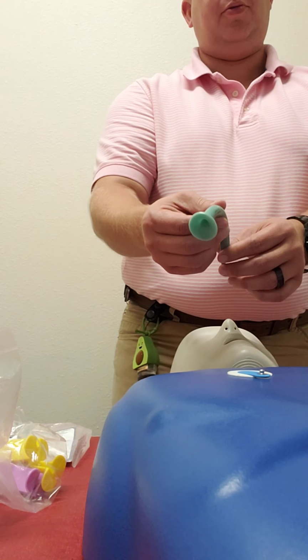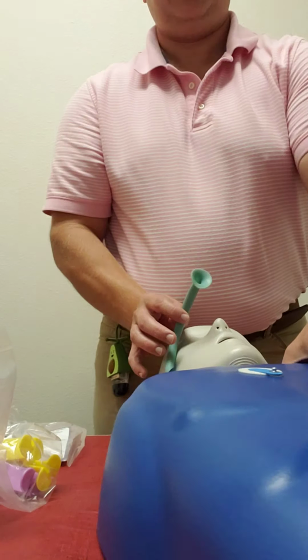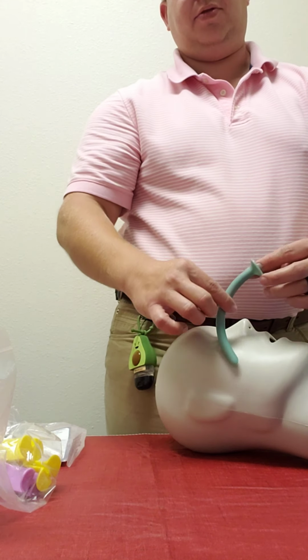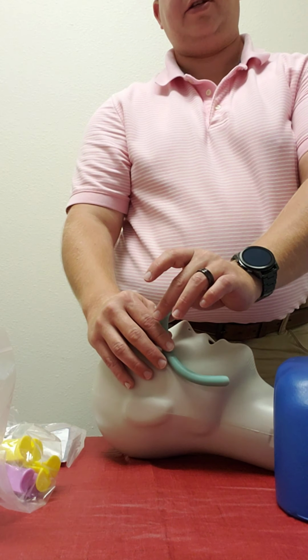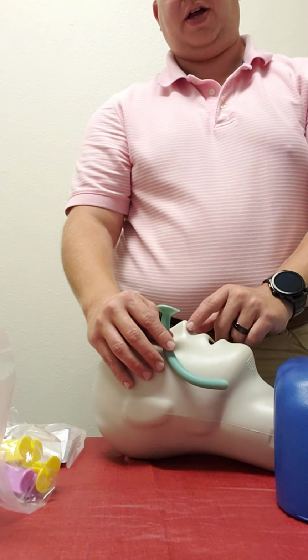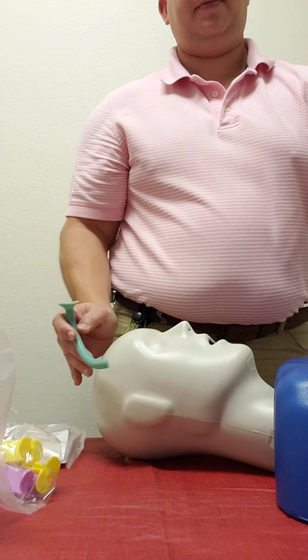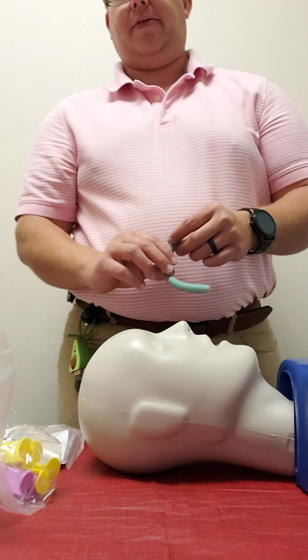Now, you're going to lubricate and you're going to insert it into the nose. You're going to insert it straight down into the nose until this trumpet is flush with the nostril. And you're going to leave it there, unless you get any kind of trauma or anything, then you obviously need to take it out.